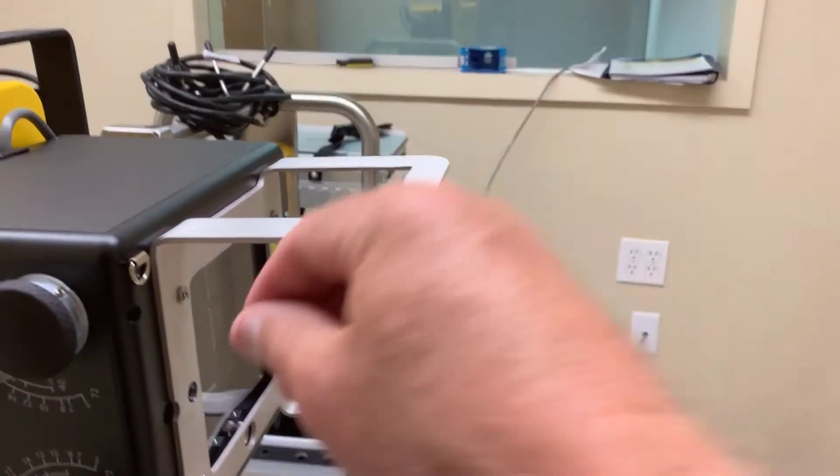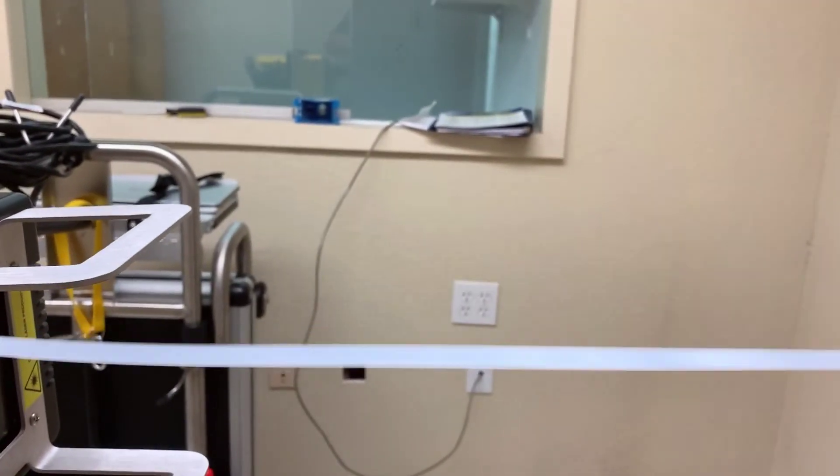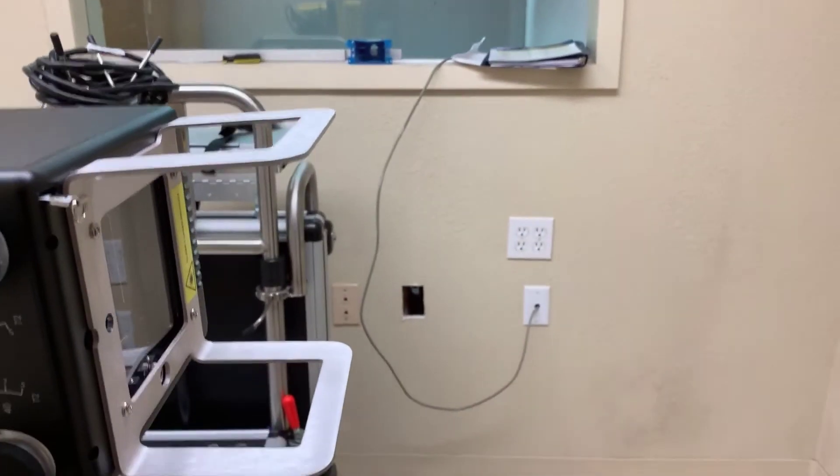If you have a tape measure, it allows you to measure the precise 72, 40, or 42-inch SID shot.